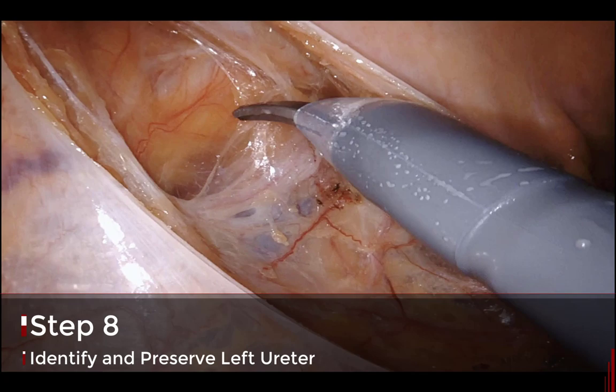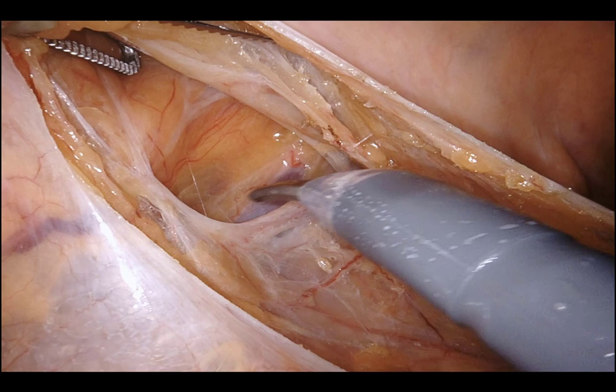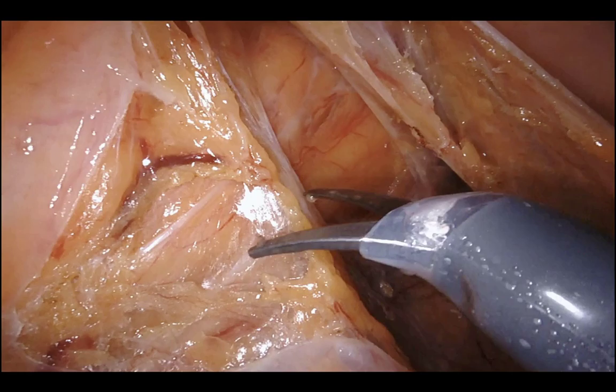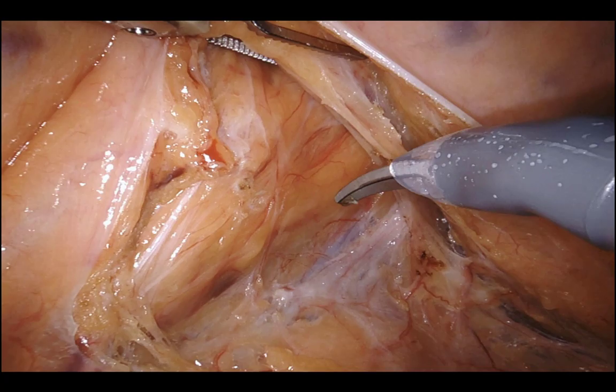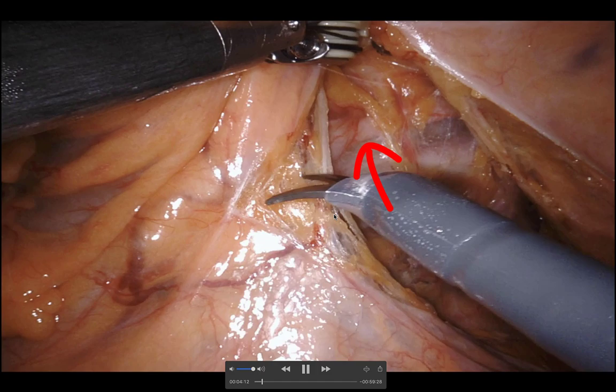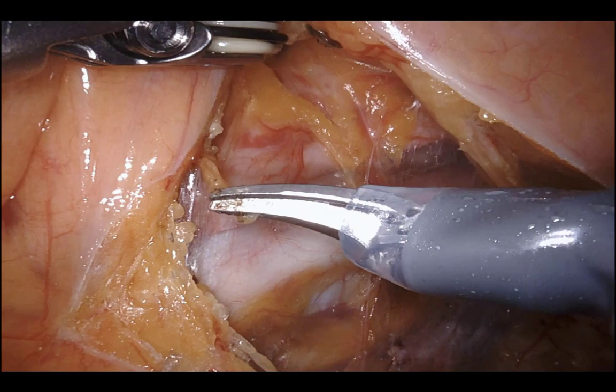I'm looking for the left ureter. Having started in the presacral space, I search in a cephalad and lateral manner. As soon as I find the areolar tissue plane I start pushing it down — hypogastric nerves go down — and I keep poking, spreading, lifting. There's the left ureter right there. I'll continue this meso-rectal and meso-sigmoid dissection proximally.